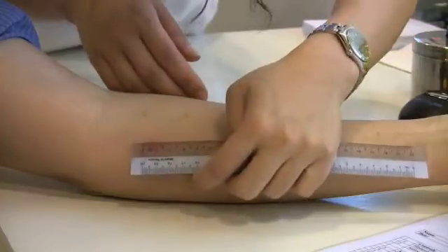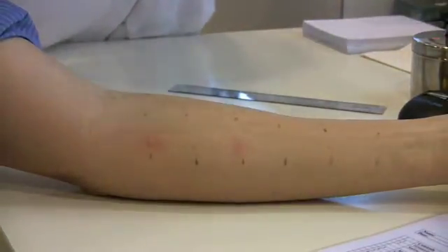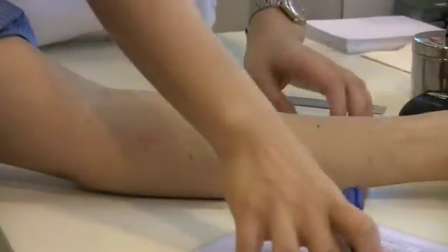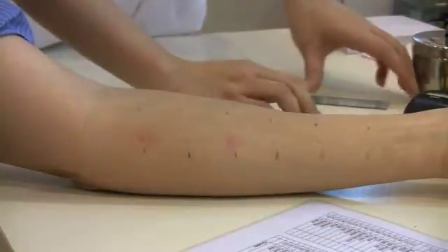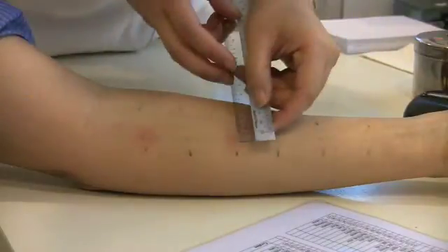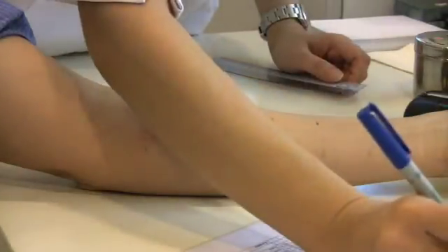The size of the wheal is measured in millimeters and recorded on the result sheet. The third position here indicates that the patient has a house dust mite allergy. The size of the wheal can be compared to that of the positive control.